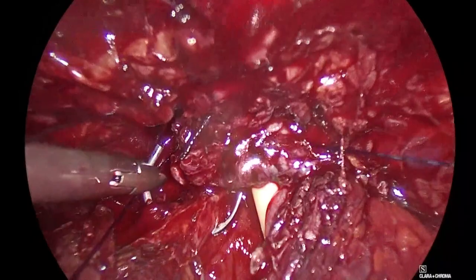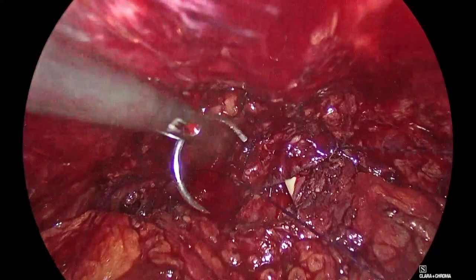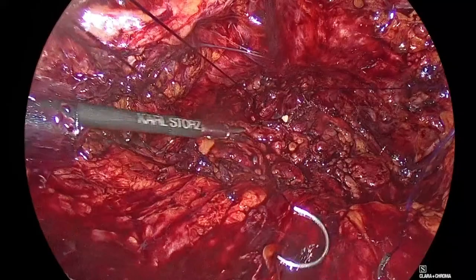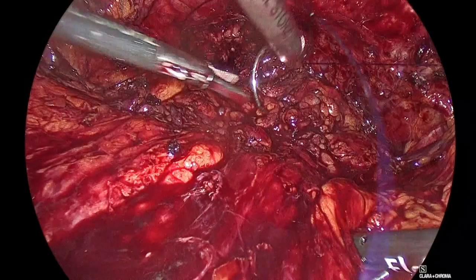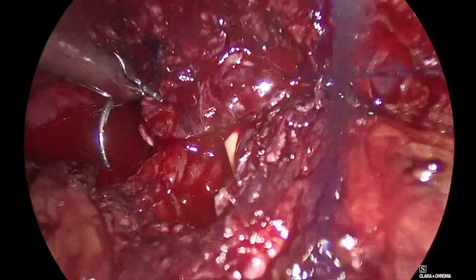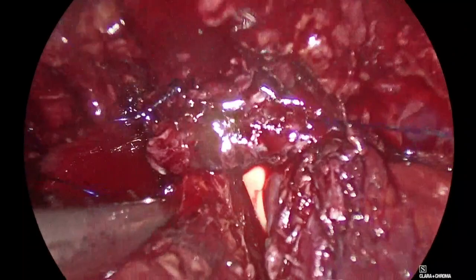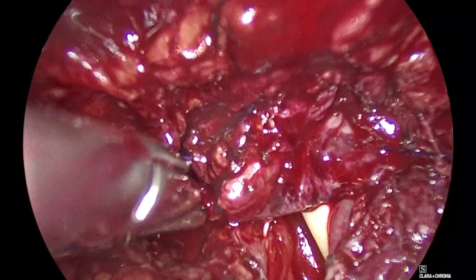Good. Left side, Padeli. Good. Go back. Check your catheter, please. Scrub nurse to move the catheter periodically. Yes. Good. She moves the catheter. She checks that I haven't blocked it. It's very important, because if you block the catheter, you need to know at which stage you have done it. Go in. Go. Left side. Good.